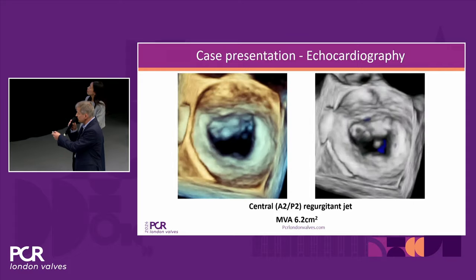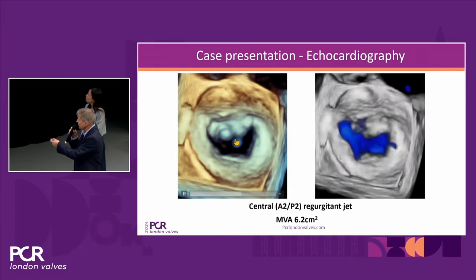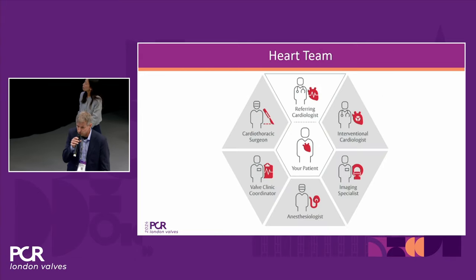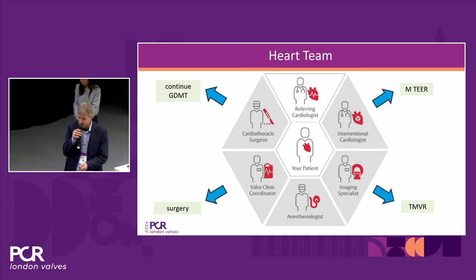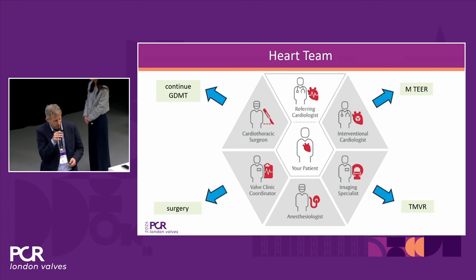On 3D echo, again, you can appreciate the gap that leads to the severe mitral regurgitation. This is a central regurgitation. The mitral valve area on multiplane reconstruction was 6.2 square centimeters. The patient was discussed in our heart team with the options of continuing guideline-directed medical therapy, surgery, mitral TEER intervention, or transapical mitral valve replacement. While we discuss the options, I'd like to invite you to make up your mind what you would do in this patient. Of course, this is a TEER session, but still make up your mind, and maybe there are other options as well. Thank you.